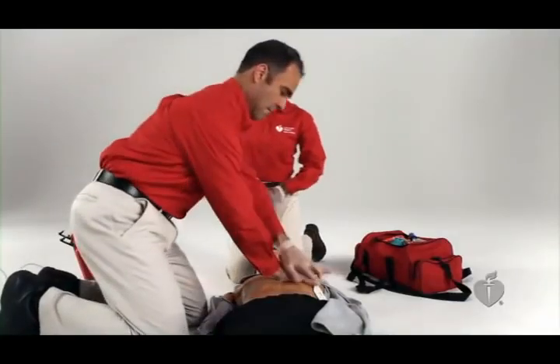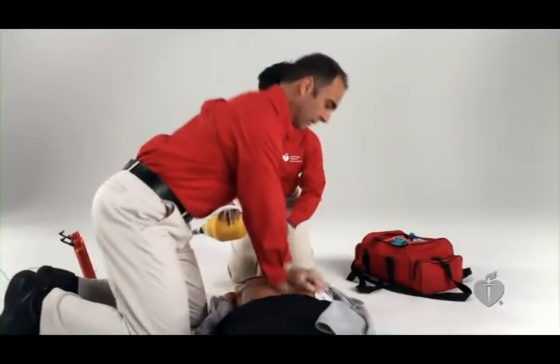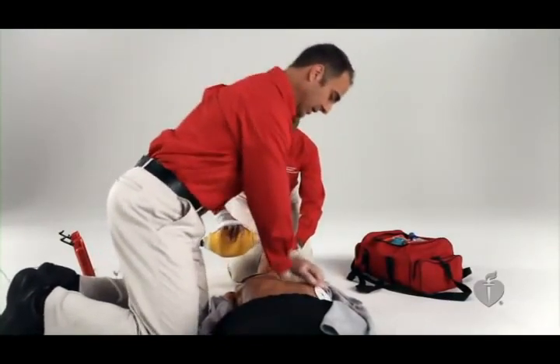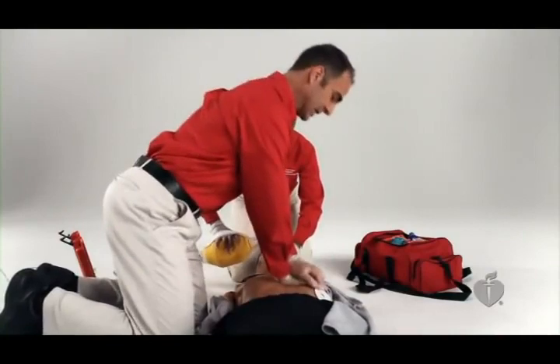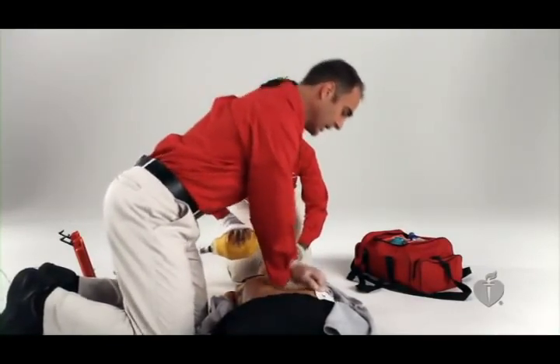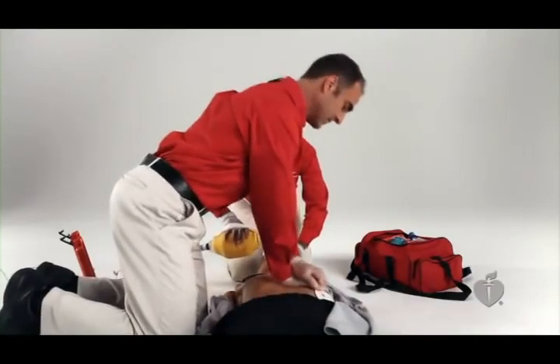The shock may produce a sudden contraction of the victim's muscles. As soon as the AED gives the shock, immediately resume CPR, beginning with chest compressions. Do not remove the AED or turn it off. The AED will repeat the analyze and shock cycle every 2 minutes.